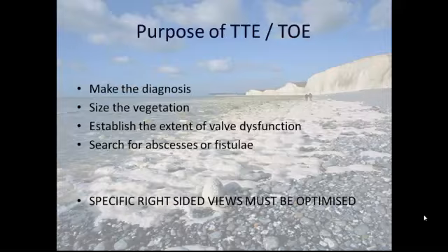So, as Tom said before, the purposes of the examination is to make the diagnosis, to establish the complications and to establish the extent of valve dysfunction.